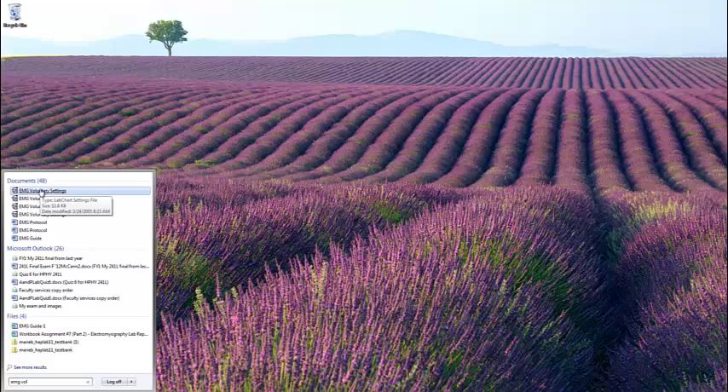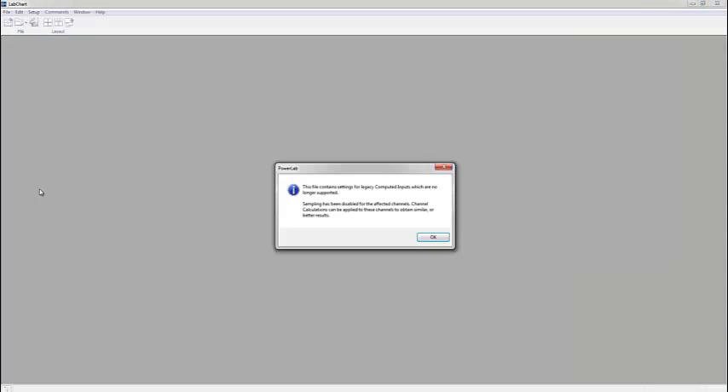That was simple and quick. When I click this, it's going to start the LabChart software. If we are connected to the PowerLab and everything is hooked up to the power and to the computer, then we're going to see a nice green play button. I have not hooked that up yet. When I click on this, the software opens and gives me a notification — this is just because we're using new software and some of the legacy computed inputs are no longer supported with the file and software we're using, so it's not going to impact us.